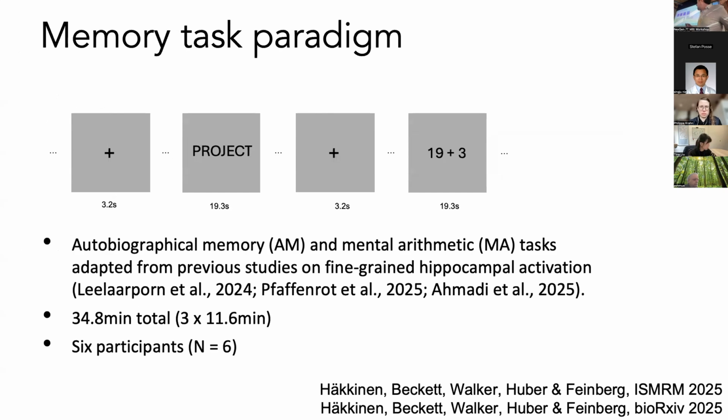And our task was an autobiographical memory task, which was contrasted with periods of mental arithmetic to try and activate hippocampus, which is known to be associated with autobiographical memory. And we collected about 34 minutes of data.